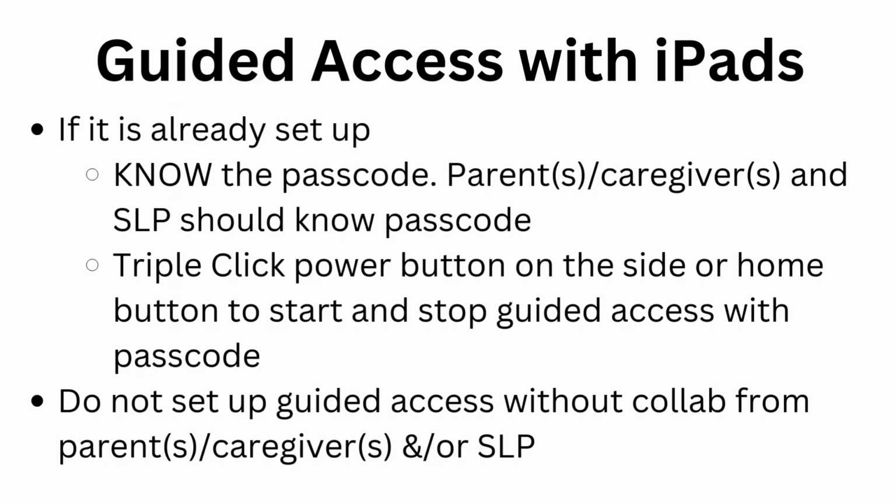So just a couple of reminders here on guided access. There's generally a passcode for it, so ask the speech-language pathologist or parents and caregivers prior to your session. To start and stop guided access, you have to triple click that home button or side button. And then lastly, always work with a speech-language pathologist if you think guided access would be beneficial for the device.